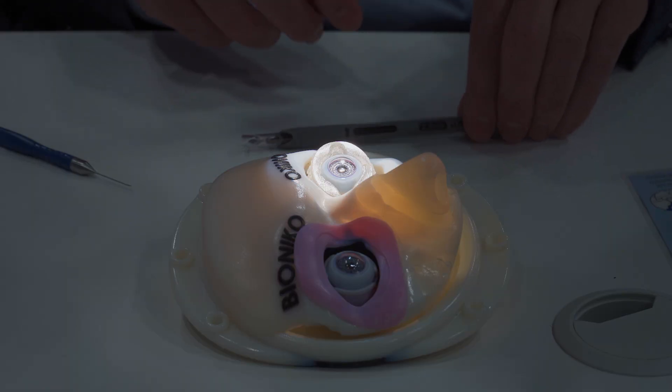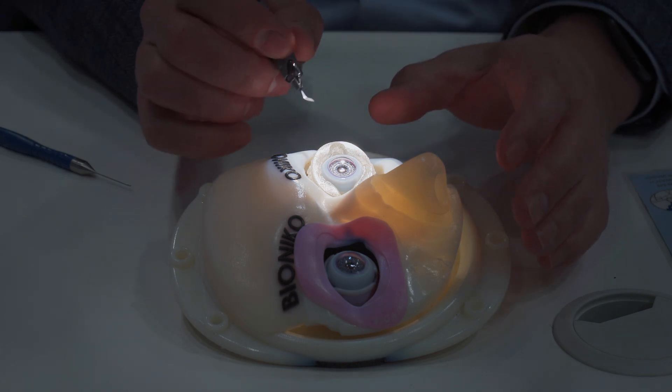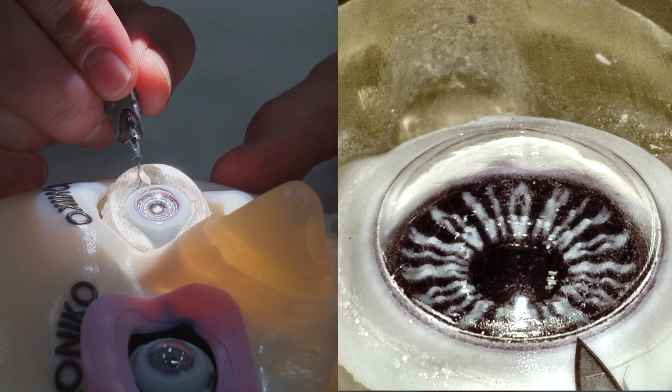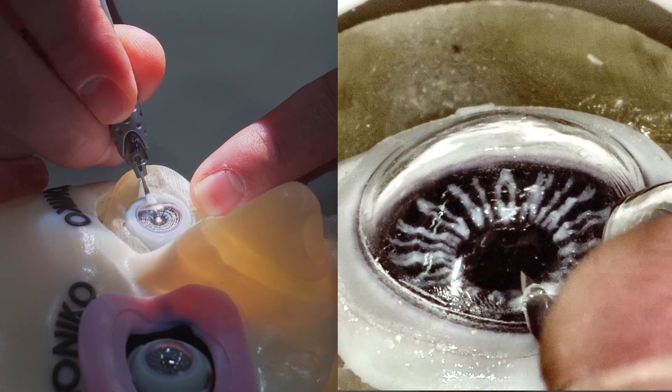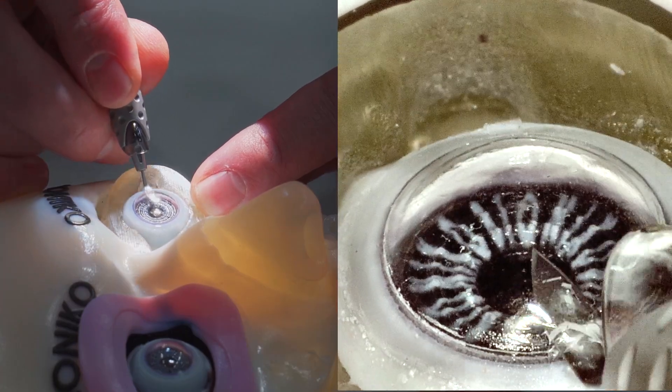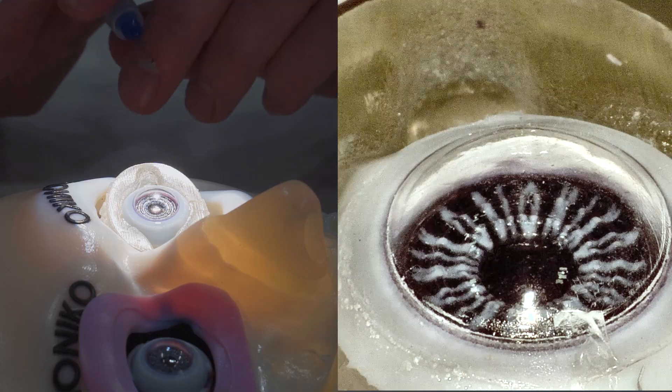We'll get started here making our main incision. After we make our main incision, we're going to fill with OVD.